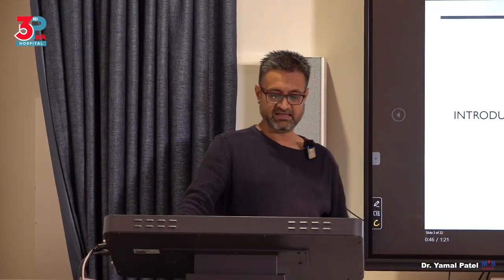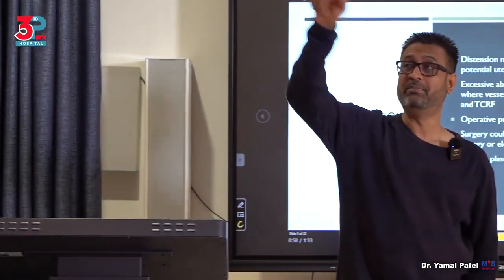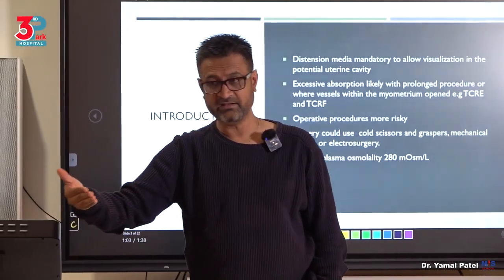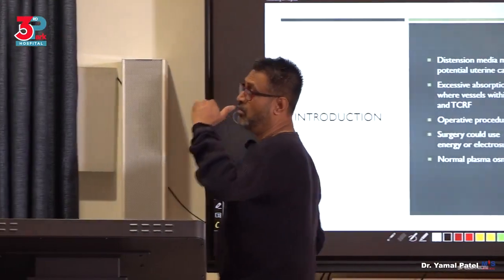We have to understand that because it's a potential cavity and you're distending it, you can get absorption of this media through the walls of the uterus, through the openings of the ostia, through the open vessels that could be there. You've understood? Through a wall that you are now going to be cutting. Let's say you're resecting the fibroid. When you cut in, you will push fluid through there. So this is a problem that you have to understand about the media.